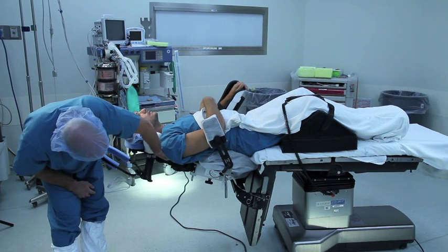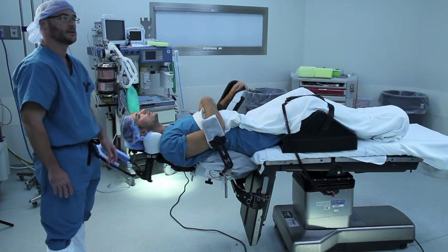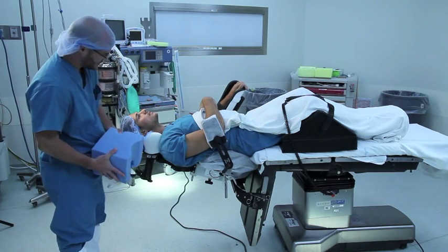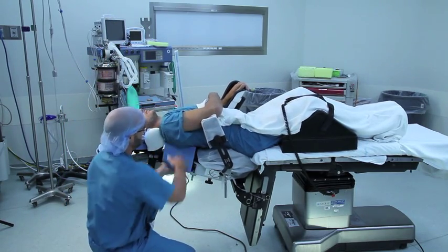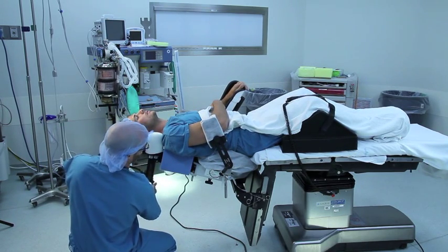Still, sometimes the thorax can sag a bit here, and in this case, we can use the optional thoracic pad to correct this. This would have been positioned prior to intubation. And for demonstration purposes, you can see how the alignment is corrected.